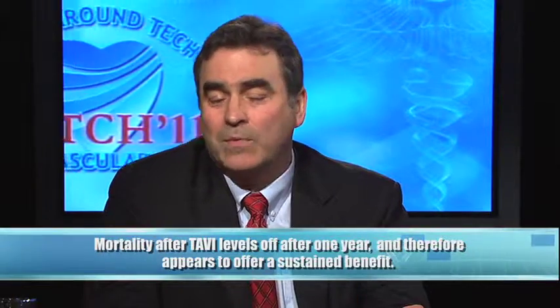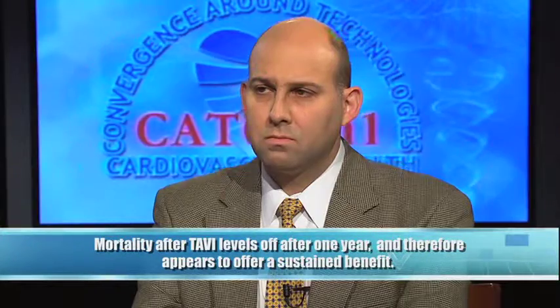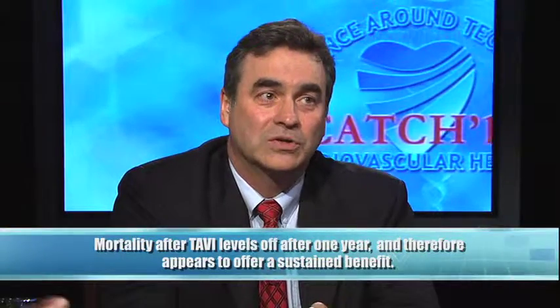Yeah, I think it's interesting. PARTNER A took high-risk patients that had an estimated risk of anywhere from 10 to 15% risk of a surgical procedure, but were still felt to be able to have a surgical procedure, and randomized them either to surgery or the transcatheter valve. The outcomes were like you discussed. There were some aspects of the transcatheter valve that had higher risk, stroke and vascular access, and certain problems with the surgical aspect, which was bleeding and the development of irregular heart rhythms after the procedure. However, the survival was the same. The problem that we look at is that the survival is the same, and out to a year, still 25% of patients died at approximately 1 to 2 years out from the procedure.